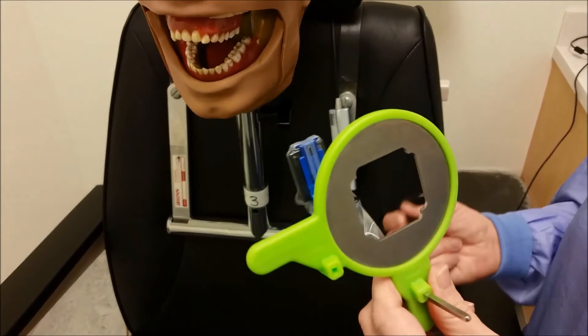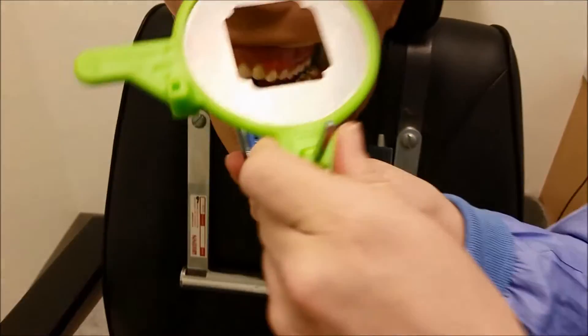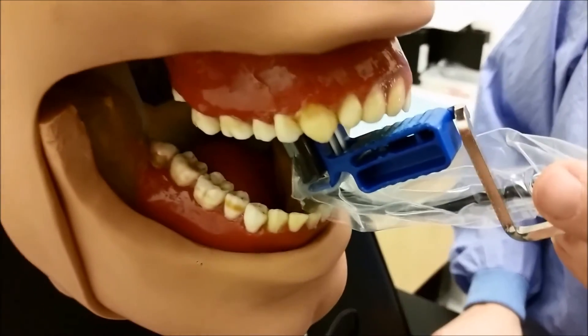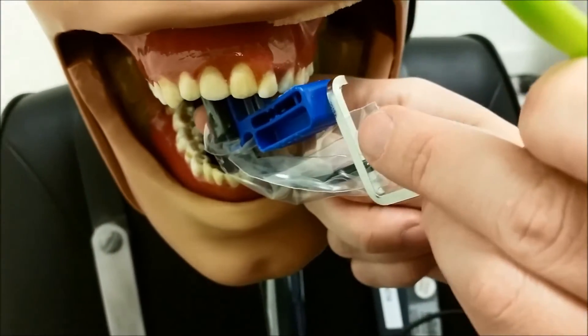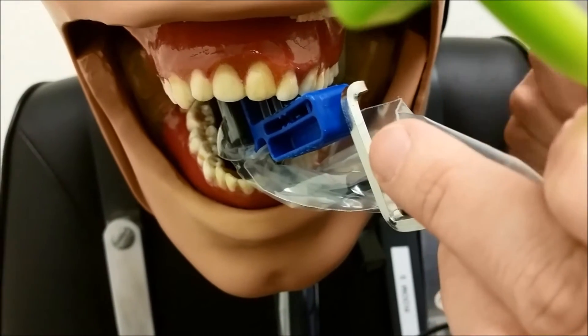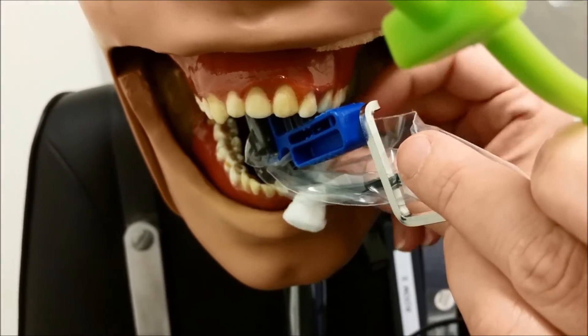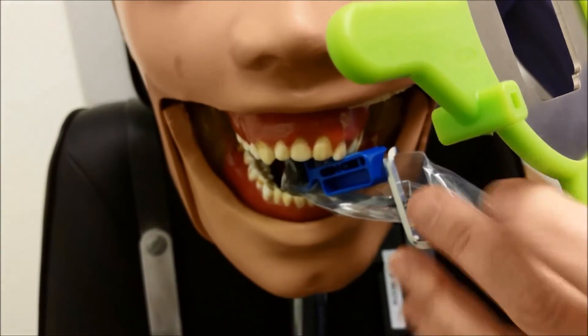I'm going to start out taking our maxillary canine. Going in at a little bit of a steeper angle helps you get in there. What you'd like to do is just center your canine on the center of your bite block. If you can fit a cotton roll, go ahead and try. If not, just go ahead and bite down.